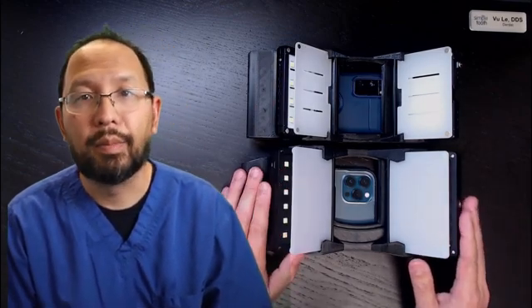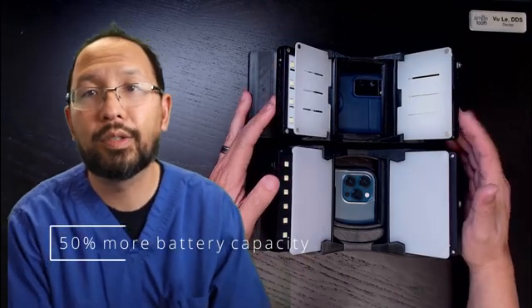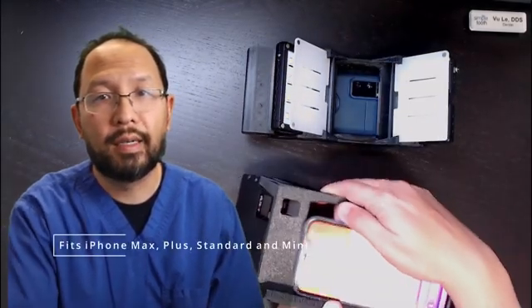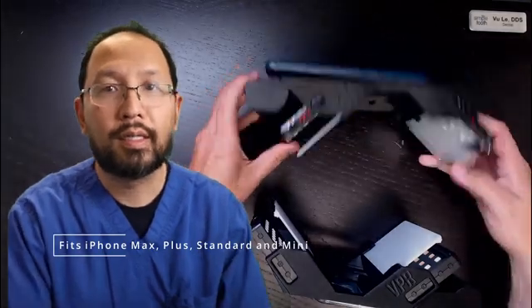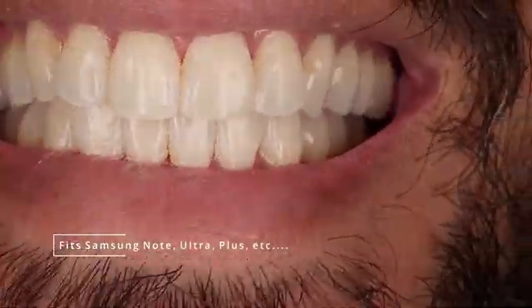For that little bit of extra size and, I'll be honest, a little bit of extra weight, you're getting a 3,000 milliamp-hour battery in each panel versus 2,000 milliamp-hours in the previous model.